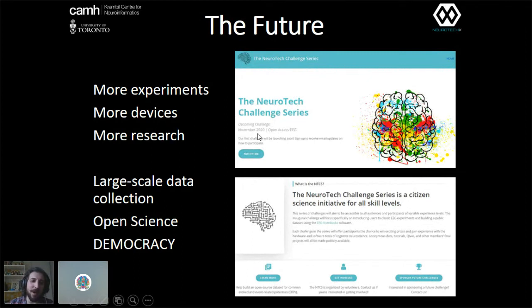We've put the date back a little bit, so we were a bit optimistic with the start time, but this is happening soon, and this is going to be trying to do what I just described. It's getting people who have a device, which is not everyone, but if you do have one, or if you're interested in getting one to do this, then you can do some cognitive neuroscience BCI research with us in the comfort of your own home and contribute to some research activities there.